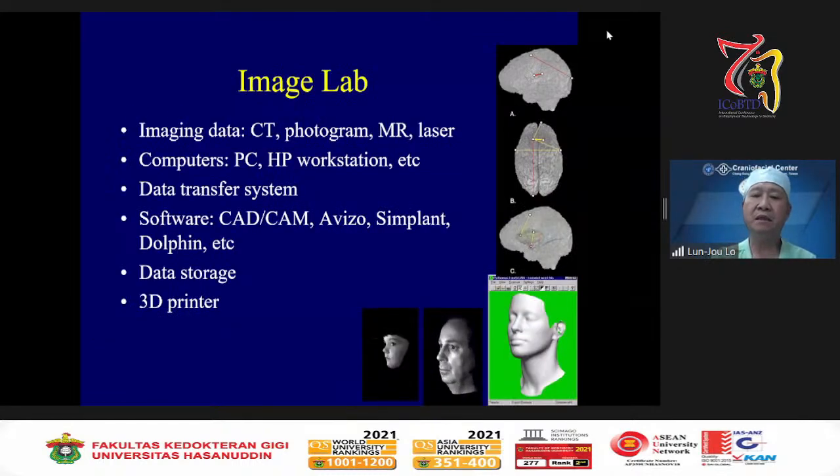What do we need now for simulation? This is the case, and with 3D imaging you can see how accurate the landmark identification and structural deviation are, and the differences and overlapping are shown using the color map. The 2D image is only qualitative. What do we need now to see?